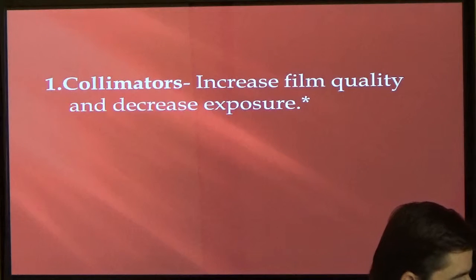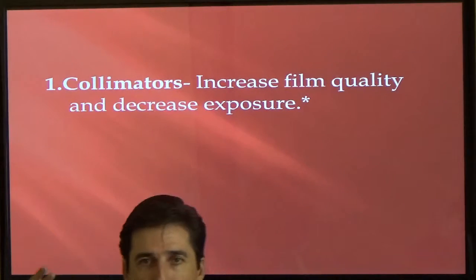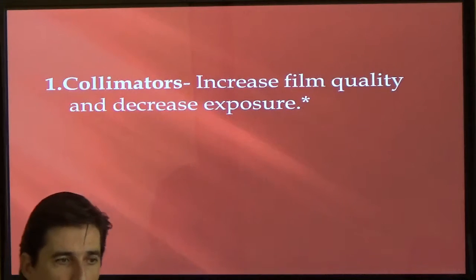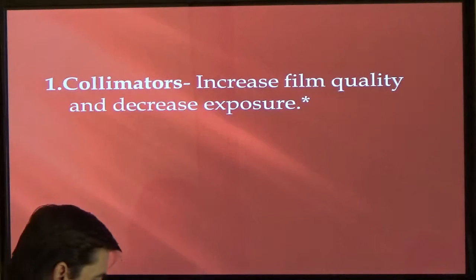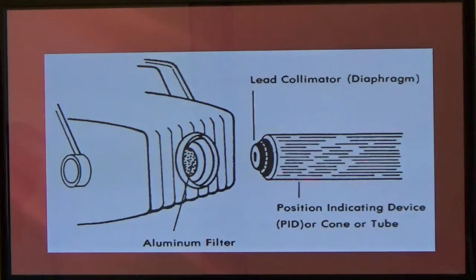They hit this collimator, and it kind of puts them all in a line so they go straight and hit your target. So basically it filters also and just focuses everything into one spot. This lead collimator here kind of directs everything down the tunnel, so that everything goes through the tube.